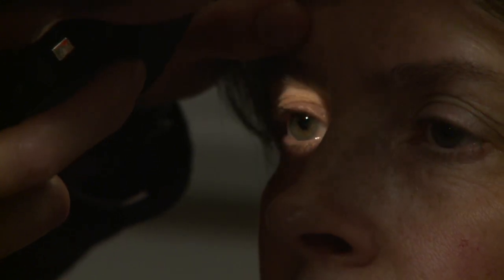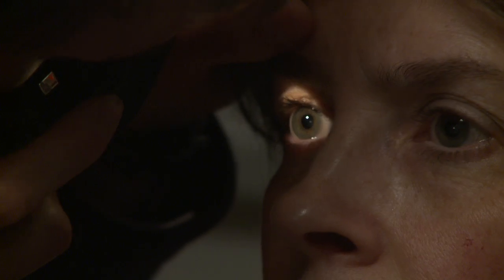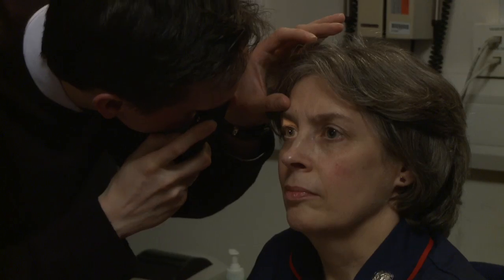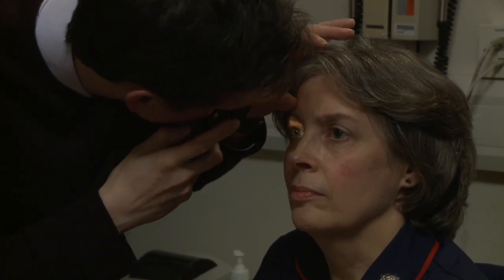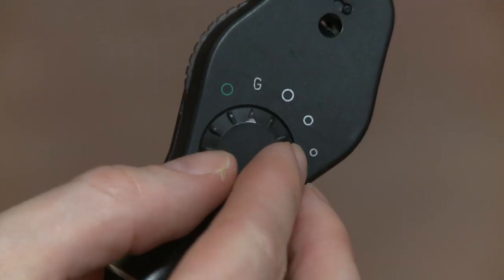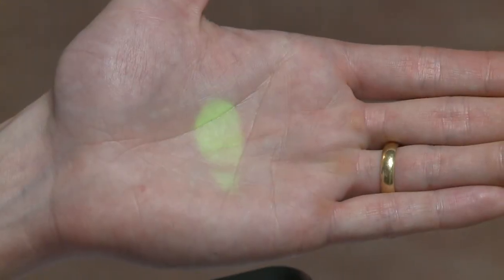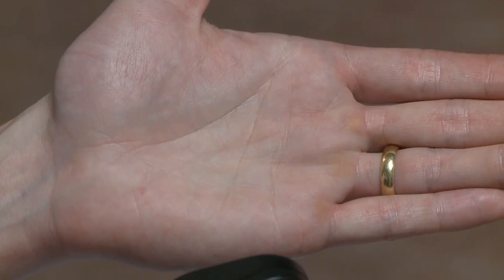Move in towards the patient, reducing the lens power as you go until a fundal feature is in focus. Although beginners to ophthalmoscopy tend to freeze when they identify a fundal feature, the trick to good ophthalmoscopy is to keep moving around. This will also help you to stay in focus on the retinal details. This ophthalmoscope also has a red-free light which can be useful in emphasising disc anomalies such as disc drusen.